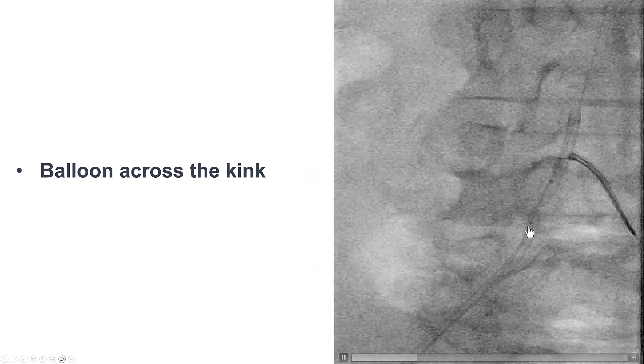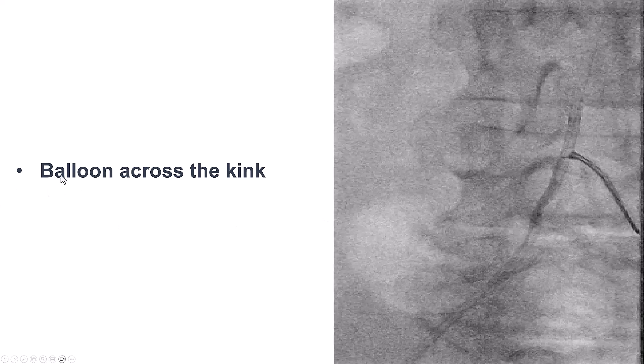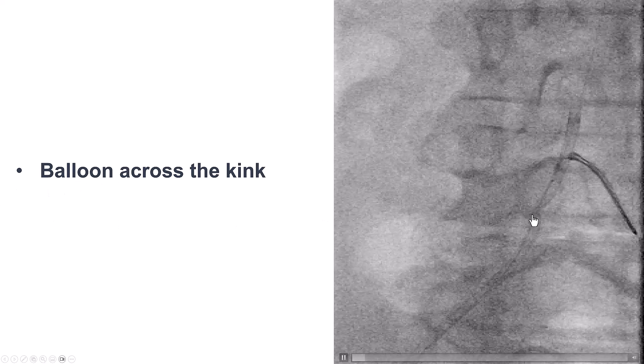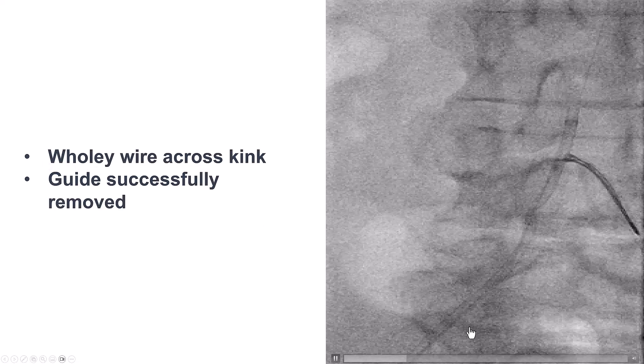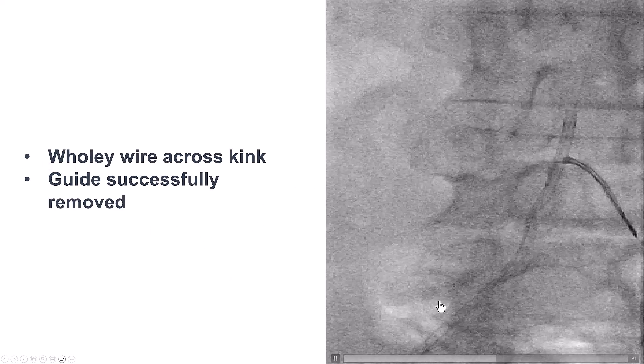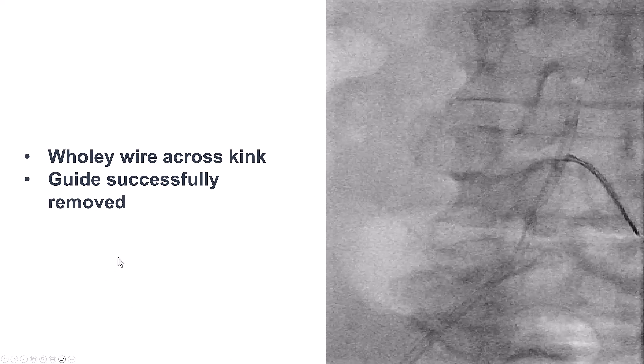Still, we needed to get the 0.035 wire through. We advanced a small balloon across the area of the kink and inflated it. After doing that, we were able to advance a workhorse wire through the kinked area, and then successfully remove the kinked guide catheter.